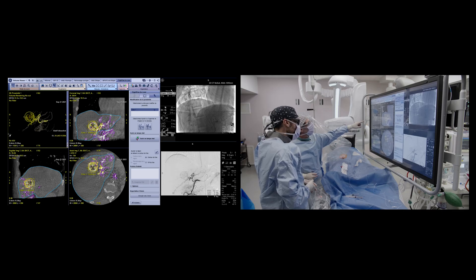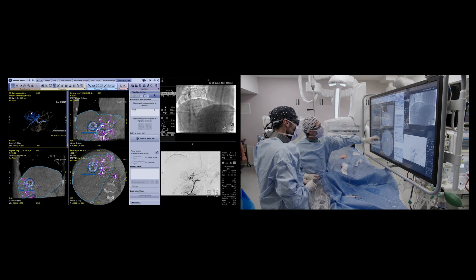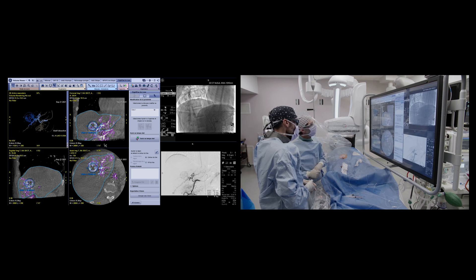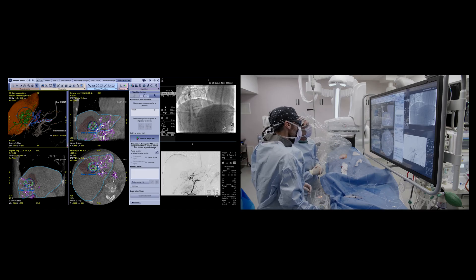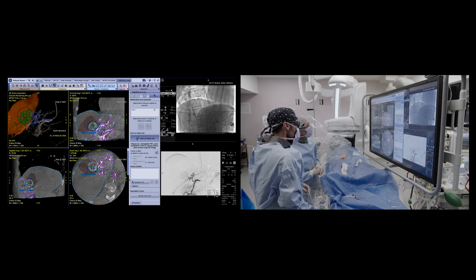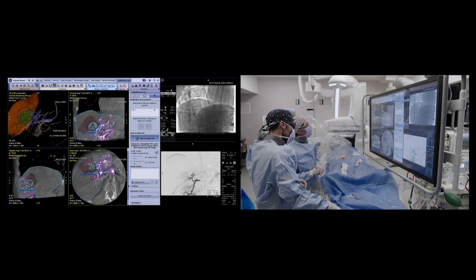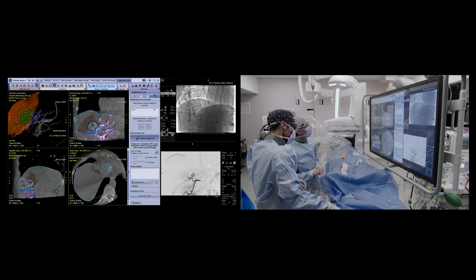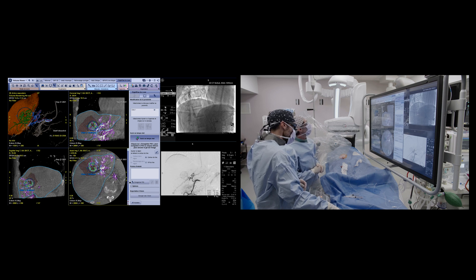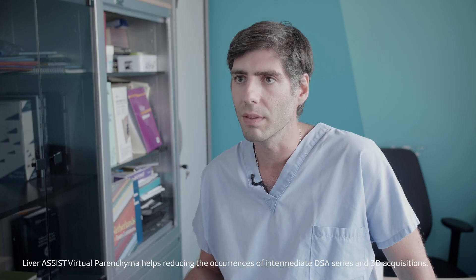Virtual parenchyma is a very nice illustration of what this kind of machine and its software can offer. It helps you to predict what you will do during your intervention and during the following interventions — namely the radioembolization treatment — without needing to repeat the injections and the 3D acquisitions.